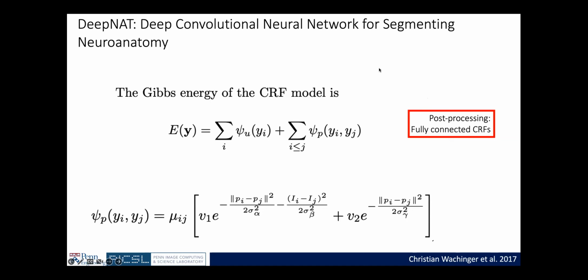So, coming back to this, I talked about eigenfunctions as a way to incorporate priors into the network. Another thing which people generally do, once you have gone through your entire network, computed your loss functions, and you get a probability map, is to smooth out the probability distribution. You can do that using a conditional random field, right? We don't have much time, so if there are some slides which don't need much attention, I'll skip or go a bit fast through them.